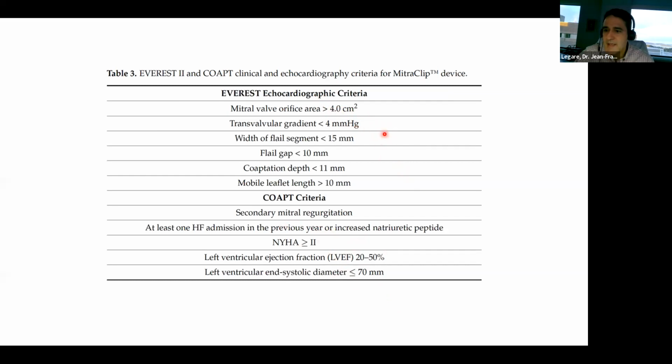And the reason for that is if we're around that close, that 4 centimeters squared, it changes our strategy for us in that it may be a single clip strategy. In a single clip strategy, we would use a wider clip because there are 4 different kinds of clip. They're either longer or shorter or wider. So they can be short and wide, short and narrow, long and wide, long and narrow. So we actually pick those things based on those measurements.